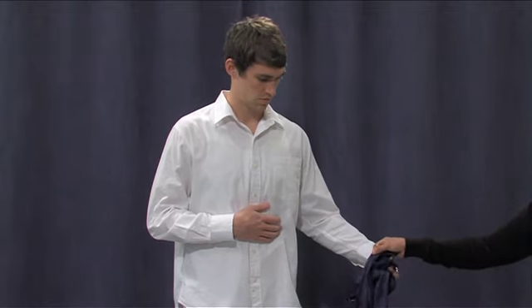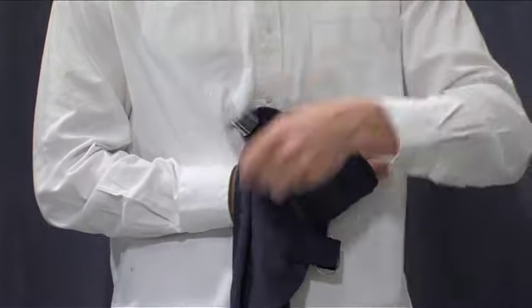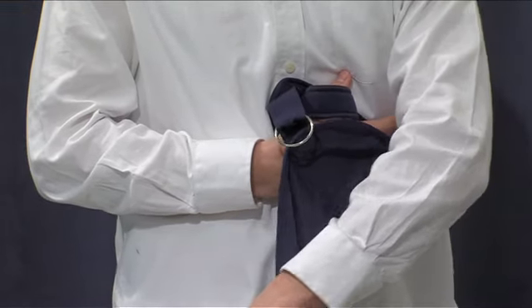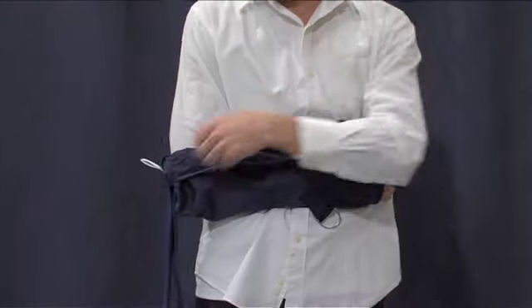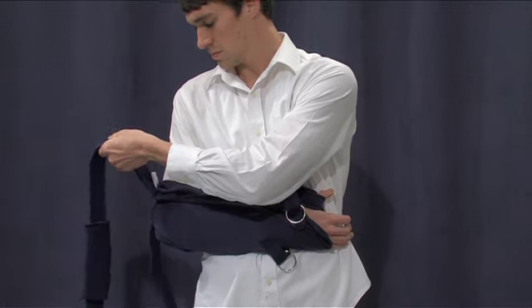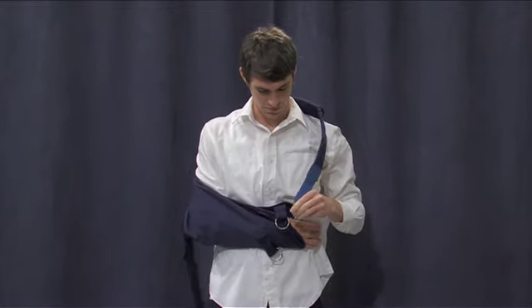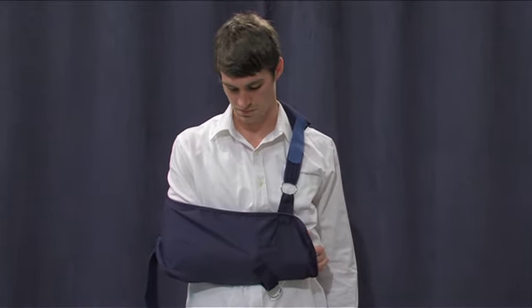Now that you are dressed, you can reapply your sling. Hold the top ring of the sling with your good arm and thread the hand of the operated arm through the gap or opening in the sling. Place your hand into the sleeve so that your thumb rests in the thumb strap. Gently press the thumb against your body to keep the sling in place while the good arm pulls the pocket of the sling up onto your elbow. Allow the elbow to rest comfortably in the sleeve, making sure the elbow is as far back into the closed end of the sling as possible. Your elbow will be at about 90 degrees. Hold on to the shoulder strap — it can be adjusted for your own comfort — and bring it over and behind the operated shoulder. Feed it around your neck and onto your chest and fasten the strap to the round ring at the top of the sling. Secure the velcro tab. Your arm is now safely held and supported by the sling.